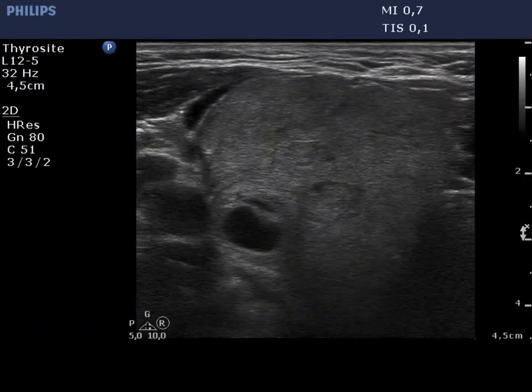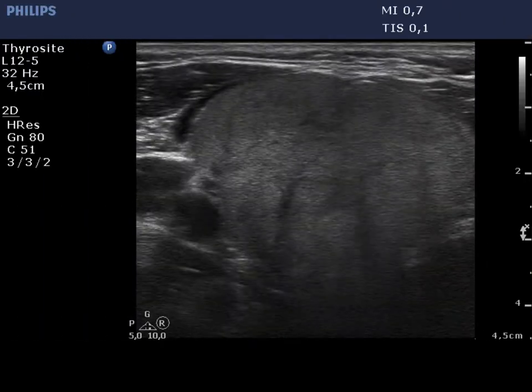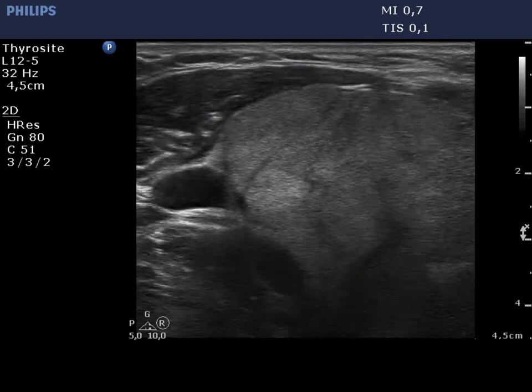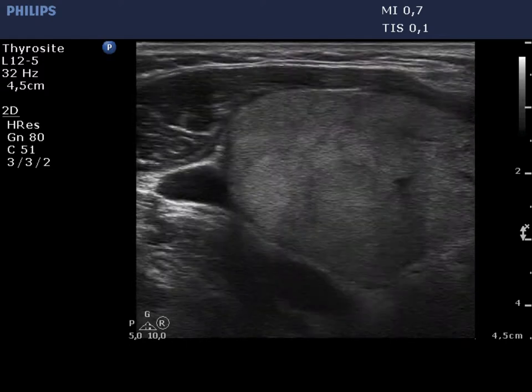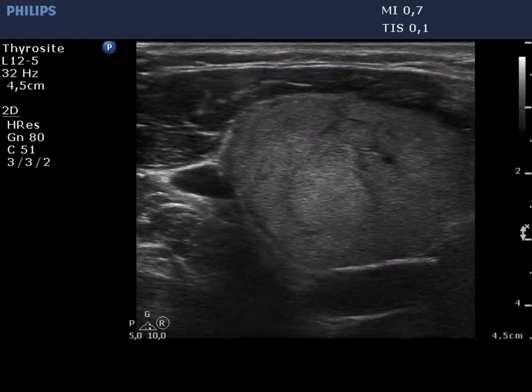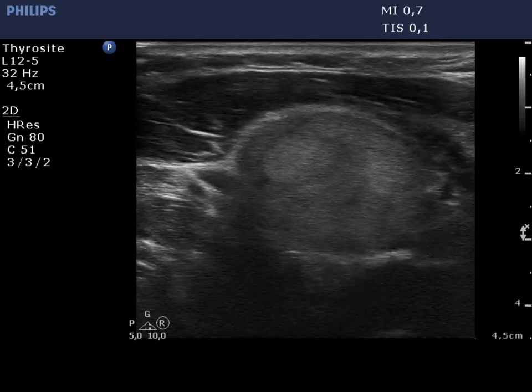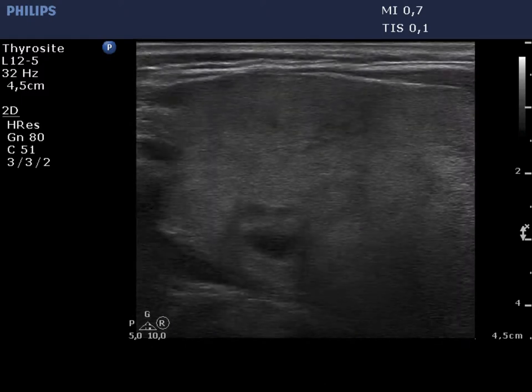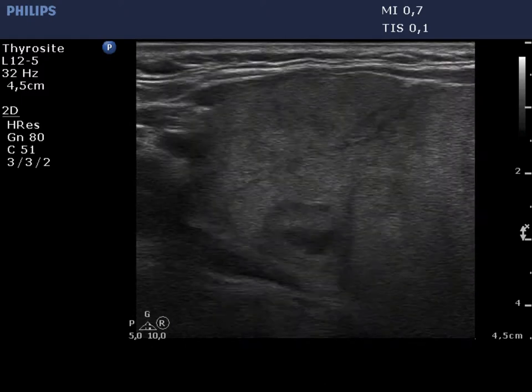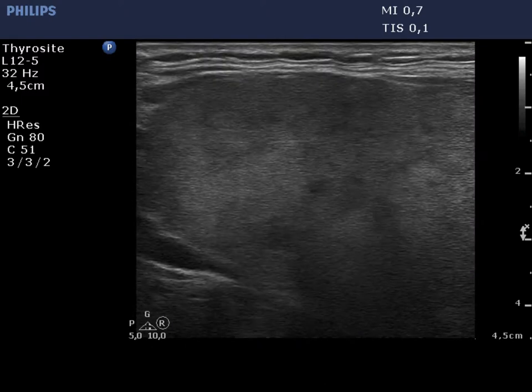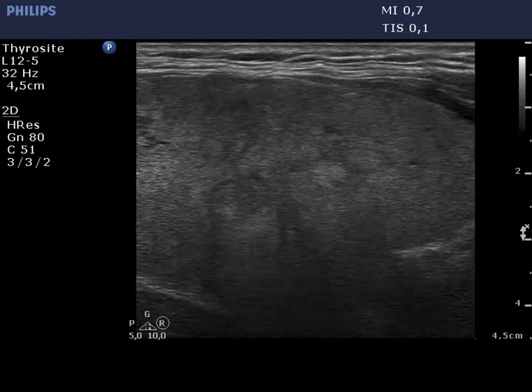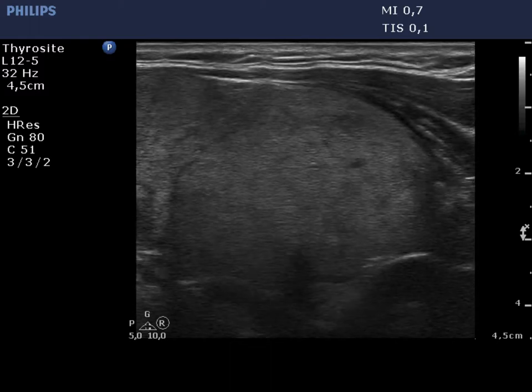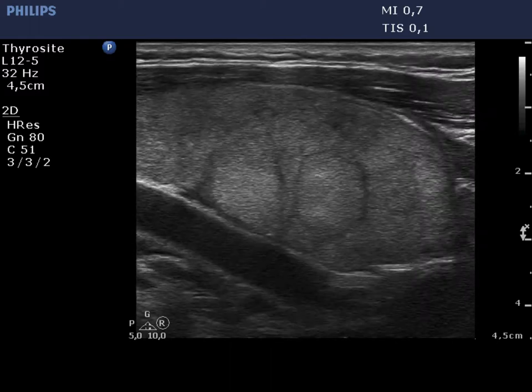The enlarged thyroid displays an isoechoic, minimally hypoechoic basic echo pattern. The lobe is divided into smaller areas, none of which carries oncological significance. This is a typical micronodular or pseudolobular pattern.